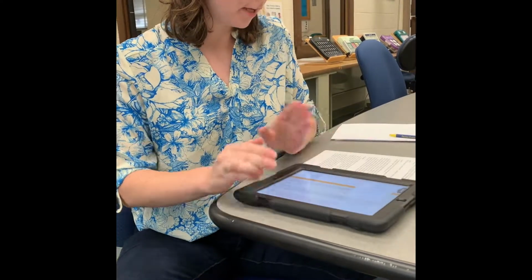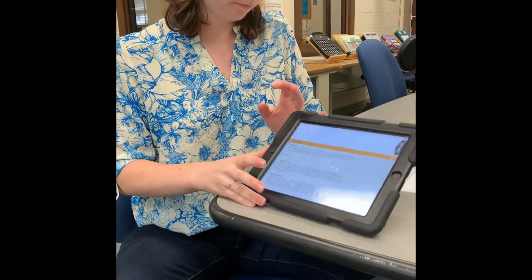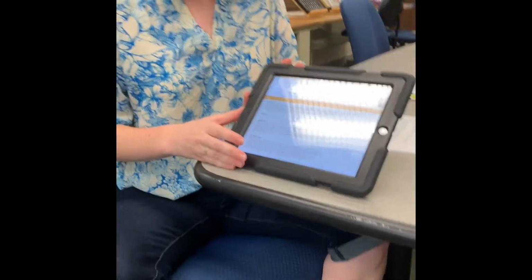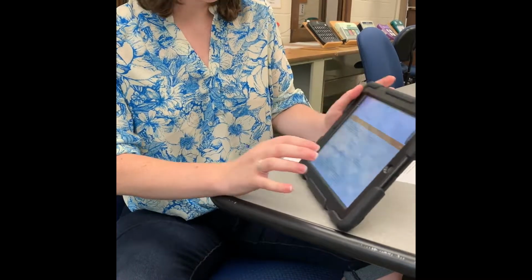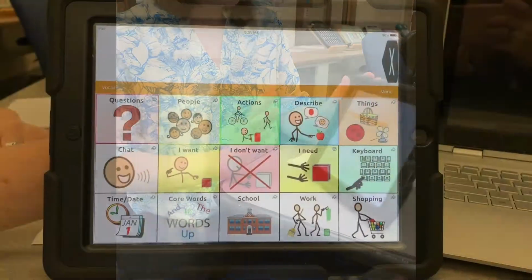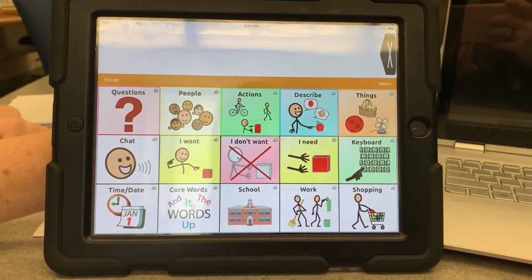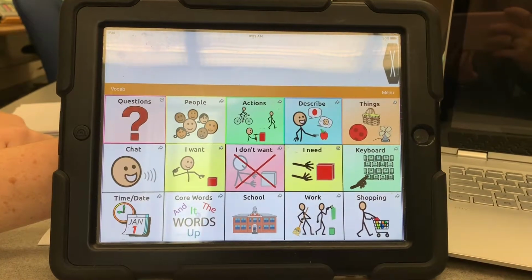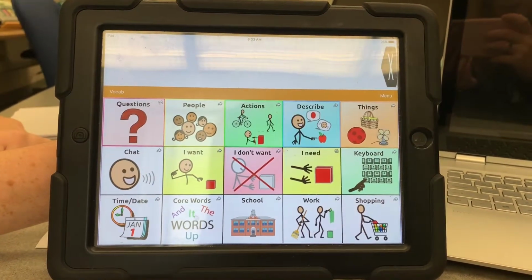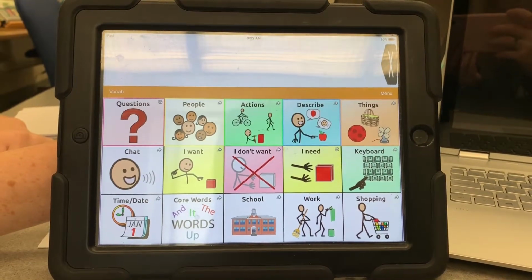Each vocabulary set includes a word finder application that allows you to search an image or phrase. When the query is searched, Word Finder will display the pathway you take to get to each individual word. A number of accessories exist for iPad devices as well as specifically for the TouchChat application. While iPad users can enable iMessage, a messaging system between Apple devices, this can be activated in the settings menu, and a step-by-step guide is available on the TouchChat website.